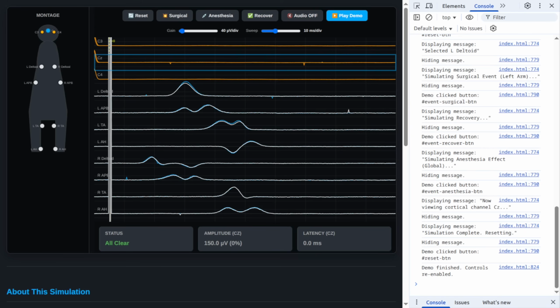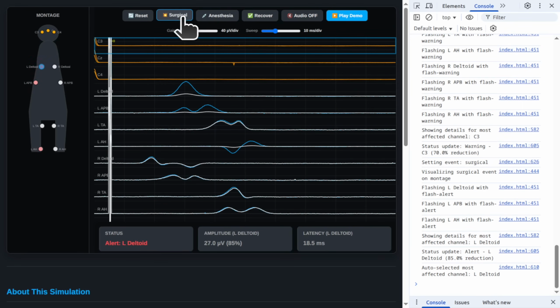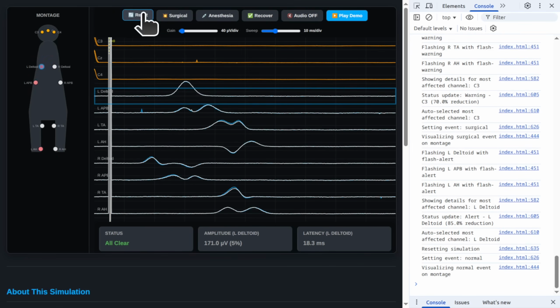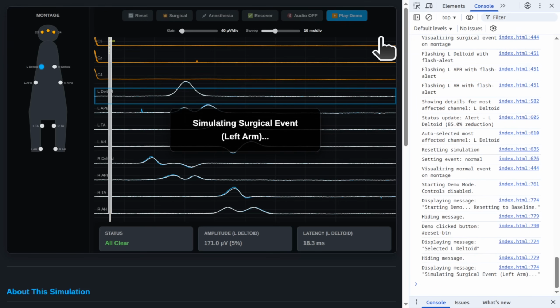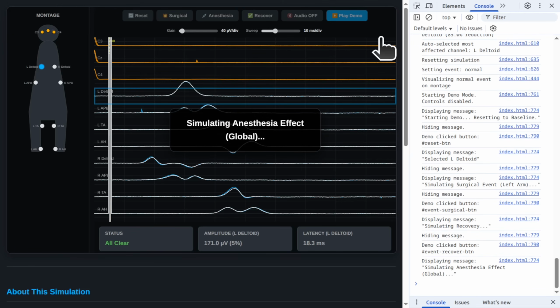Okay, so if IOM is this crucial safety net, how does a tool like this simulation actually train someone to use it effectively, to interpret those really critical signals? Good question. Our mission in this deep dive is to unpack exactly how this high-fidelity simulation helps clinicians, technologists, students too, master that complex skill of interpreting the electrophysiological data. Specifically, how it trains their brains to recognize those significant changes that indicate neurological risk.